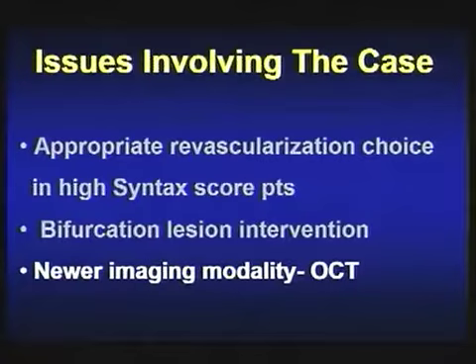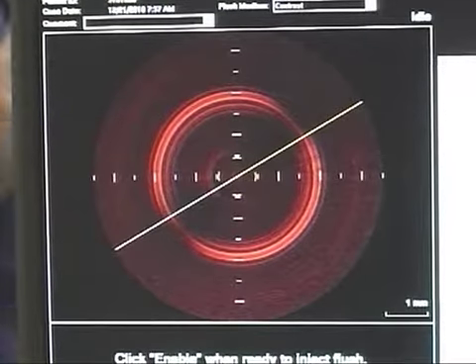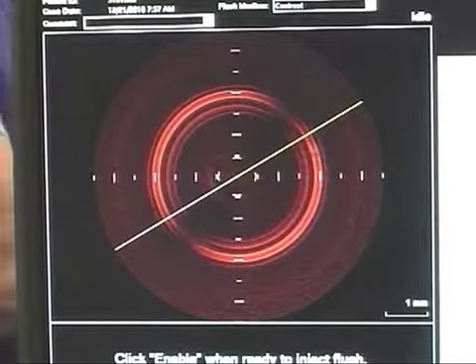With that, knowing that last month we had a lot of discussion and points on infrared spectroscopy which was used, I felt that we show another imaging modality, which is the optical coherence tomography, OCT. We have to show it live. Are you ready to show live now? Can we show it? Now we will show OCT live, and then we will talk about the theory.